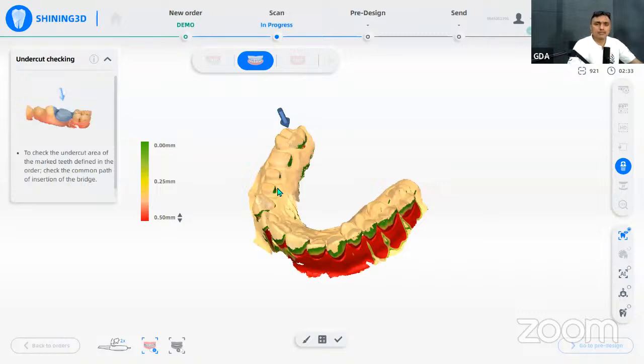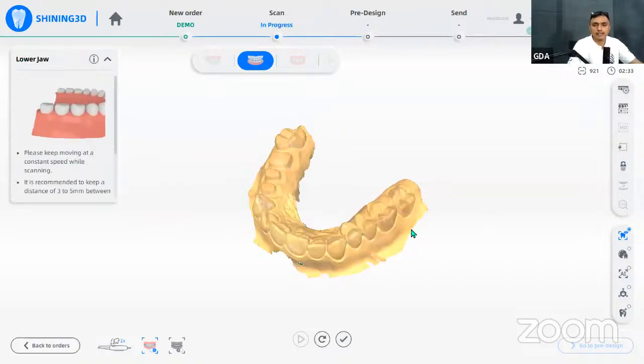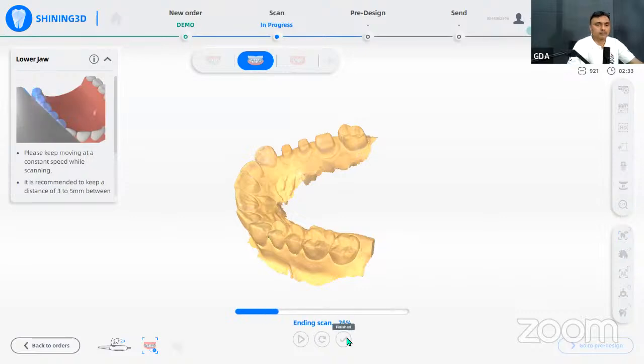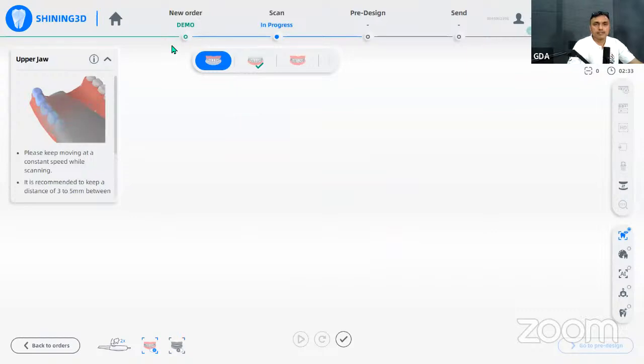All these things come naturally to a software. You don't have any great amount of work that you're doing at this point in time. You're just pressing a few buttons and saying yes, that's what I want. So the same way you go ahead and you can do the mandibular arch and do the bite for you, and then it optimizes and finishes it. So I just want to come back into this. So I go back here.